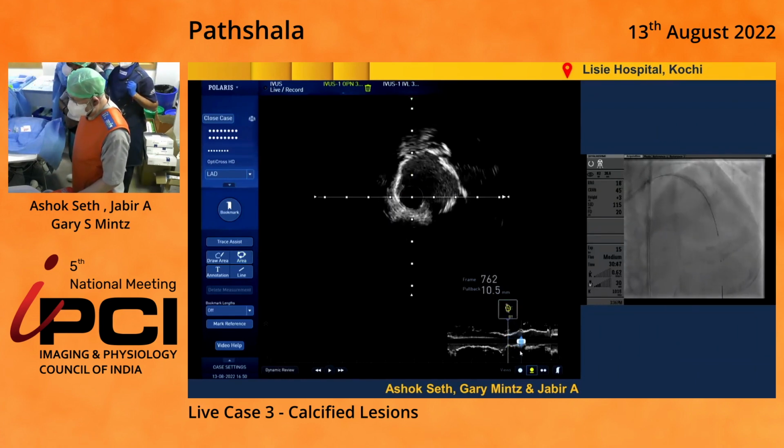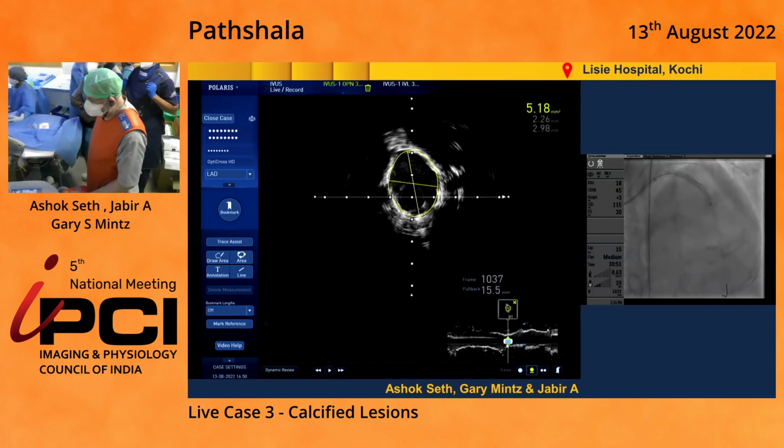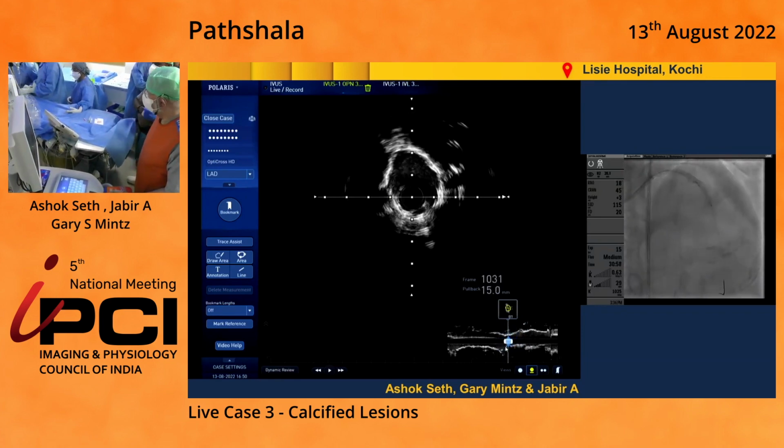Okay, so Larry, now I'm going to be at the lesion itself so that you're not having a pullback and you're really looking at the lesion. It's manual. Okay, let's go manual. Yeah, no pullback.